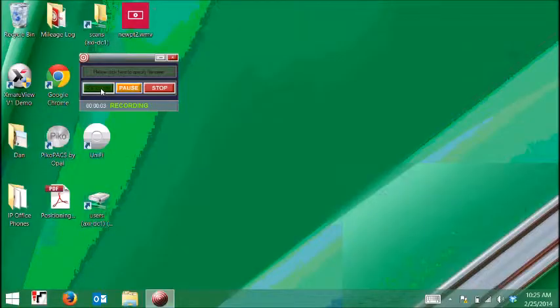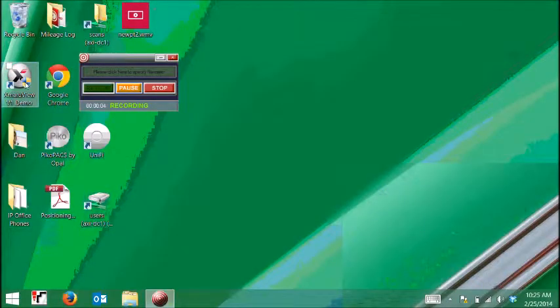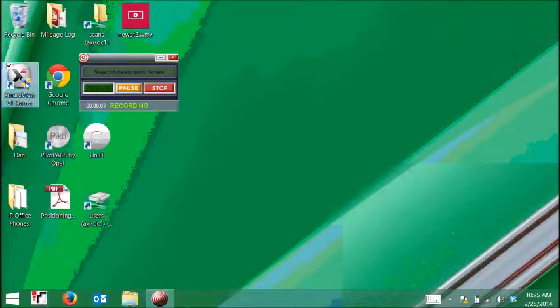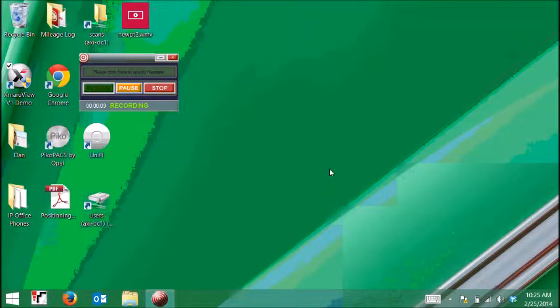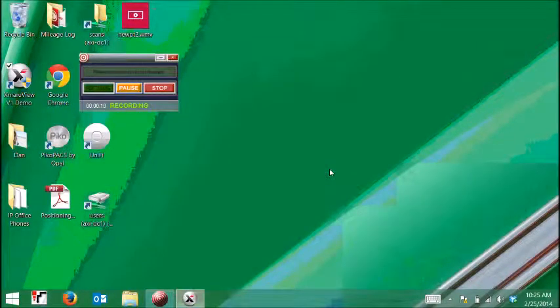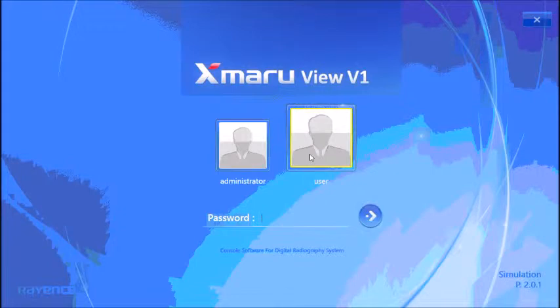To begin a new patient, start by opening the application by double-clicking the Exmaru icon on your desktop. As a user, enter your password 1234.